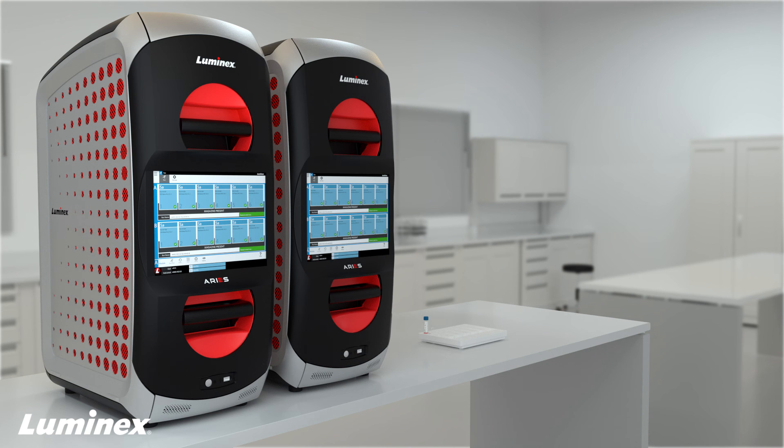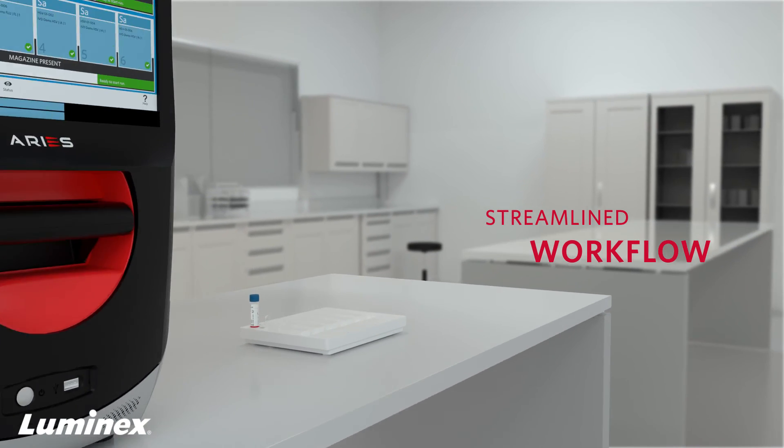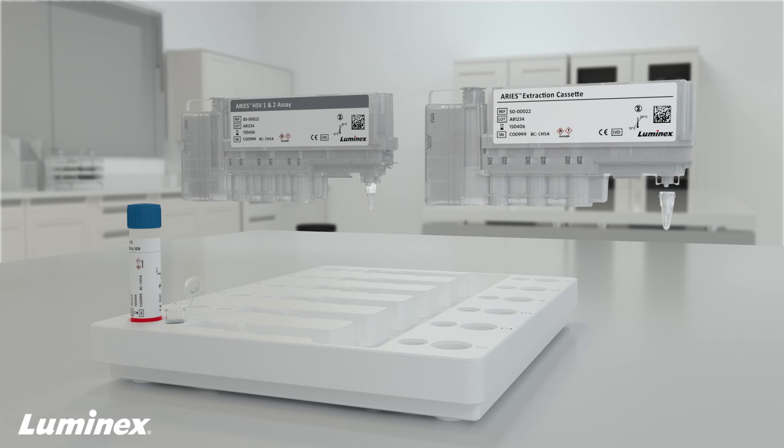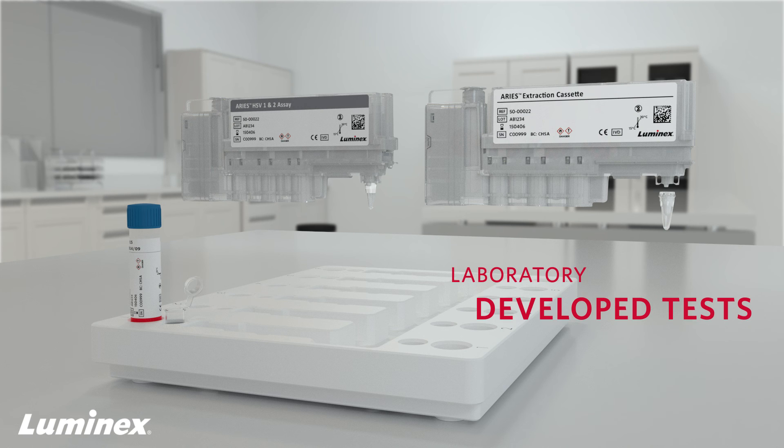Let's take a closer look at how Ares streamlines laboratory workflow. IVD cassettes are preloaded with lyophilized reagents in the attached PCR tube. Cassettes for nucleic acid extraction come with a snap-on PCR tube that enables you to collect extracted nucleic acid or add your own PCR reagents when developing and running LDT assays.